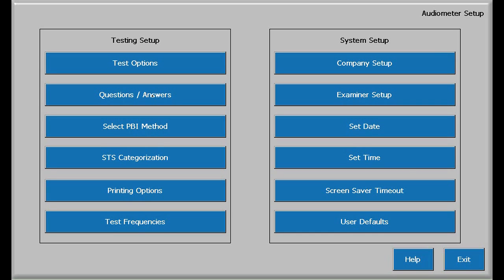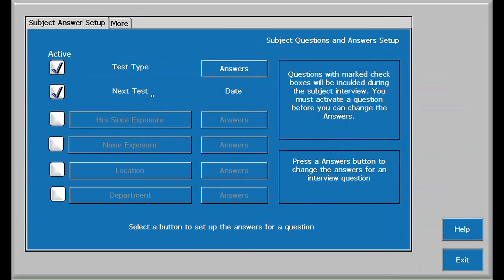Touching Questions and Answers will allow customization of demographic questions and answers related to the subject or employee's audiogram test. If checked, the questions and answers can be entered before, during, or after the test is complete. Fifteen questions and answers on two display screens can be selected and edited. The first two questions, test type and next test date, can only be checked for selection. While the test type answers can be changed, I don't recommend it, because baseline comparisons are based on these answers.